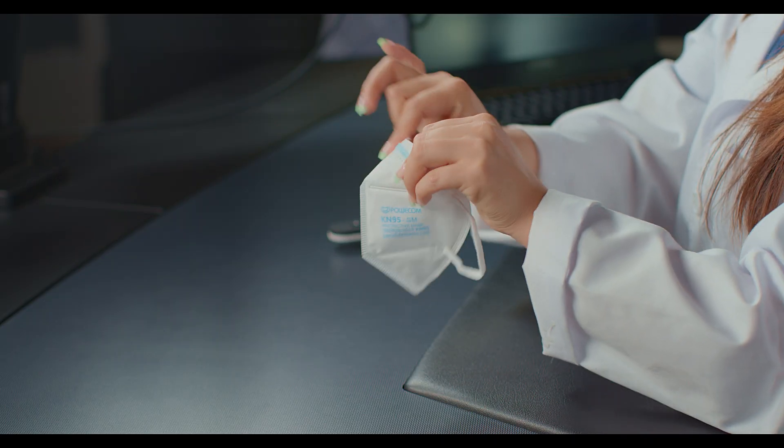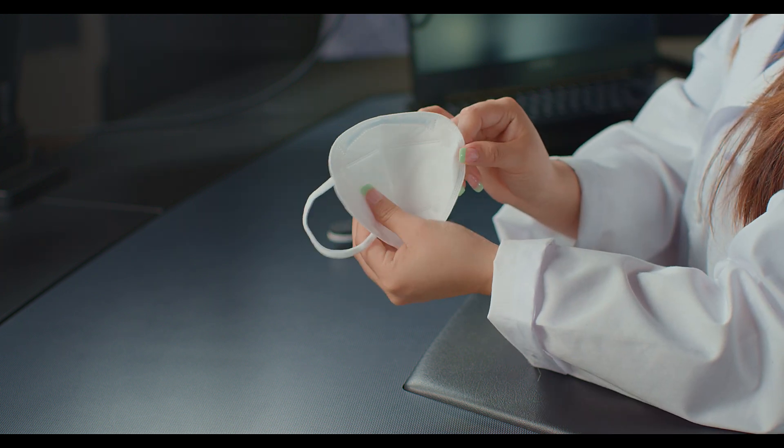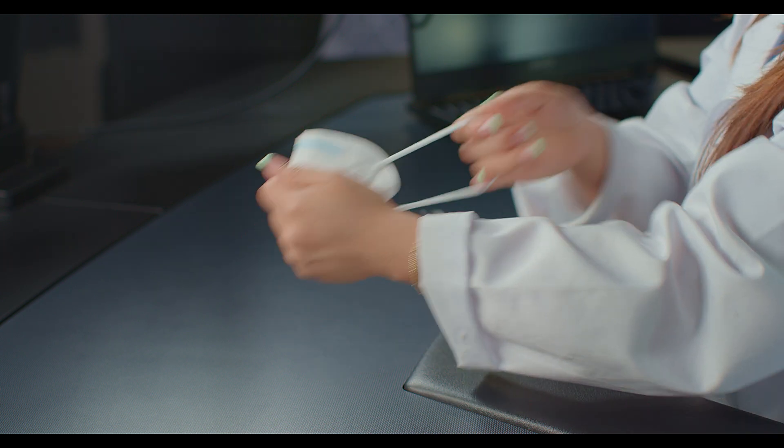Pretty solid nose wire — it's not flimsy. This is how it looks from the inside. Let's go ahead and try one on. I am going to flatten out the nose wire before I place it, and this makes it a lot easier for me to adjust the nose wire to my face.